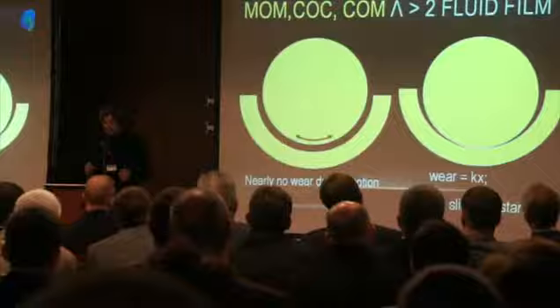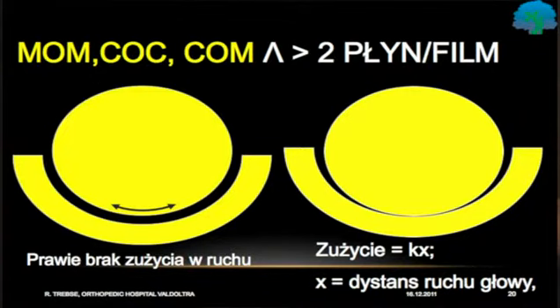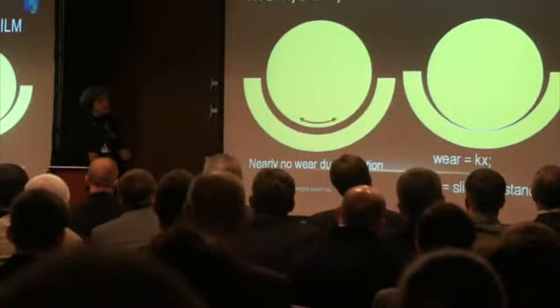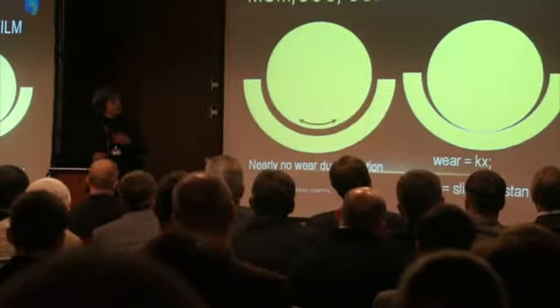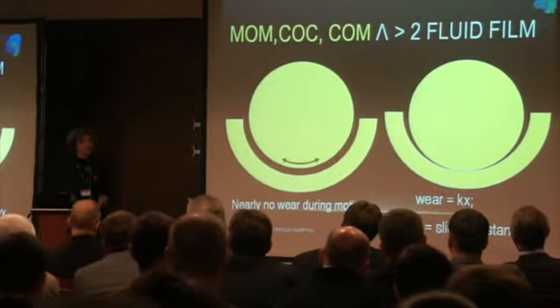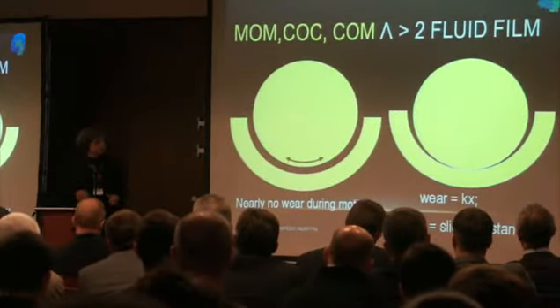On the other side, it is a different issue in hard-on-hard bearing. During motion, we are nearly into the fluid film lubrication because of these better properties of the material, and there is nearly no wear. But while we are standing still and slowly moving around, we are again in boundary regime, and wear is directly proportional to sliding distance. So increasing head size, we improve this, but it's already good, but we deteriorate this. So the final result is actually depending on the activity pattern of the patient.